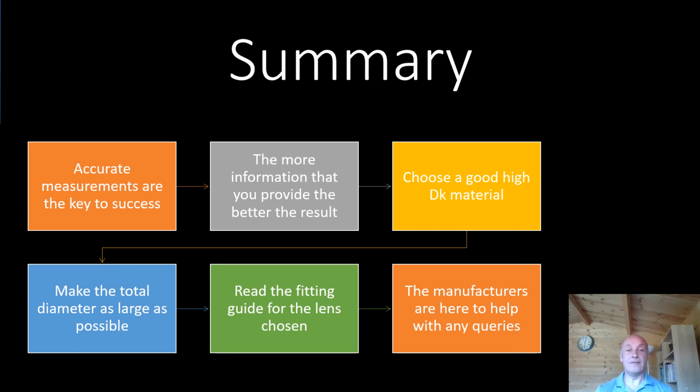Please do have a look at the fitting guide for each lens. It may be slightly different. Some lenses are fitted on flattest K, some are fitted 0.5 or 0.05 steeper than flattest K. And manufacturers are here to help you with any queries that you might have.